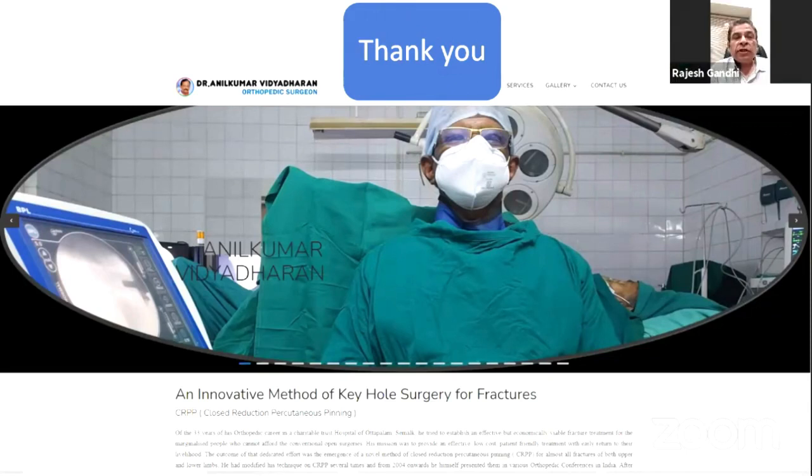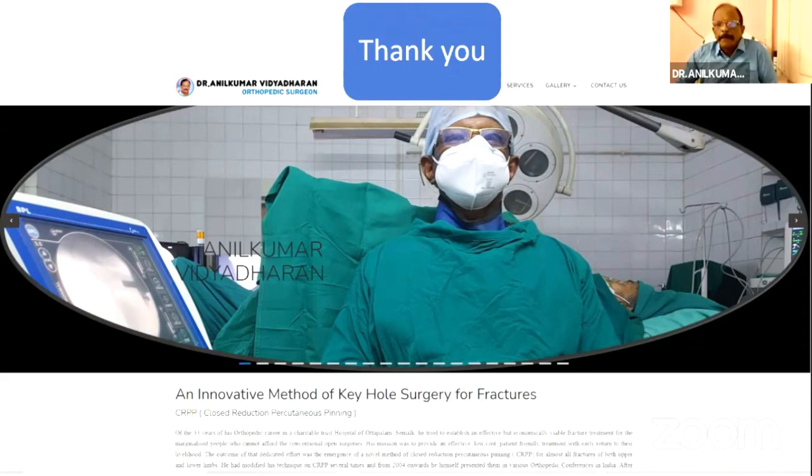Yes, sir. Dr. Saab, very good presentation, very informative and very encouraging also. Now, one thing which I have always been surprised about is how many times you are worried about the spike piercing through the anterior muscle mass and possibly hurting the brachial plexus, brachial artery. Do you commonly encounter that?